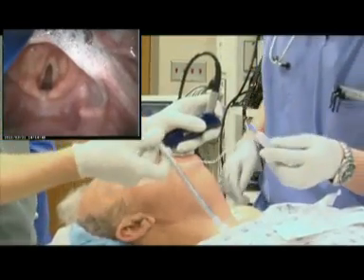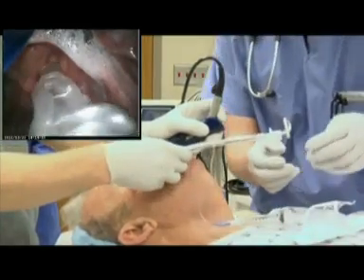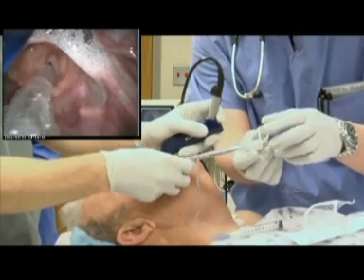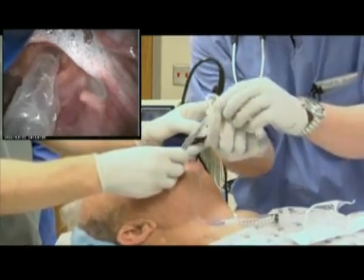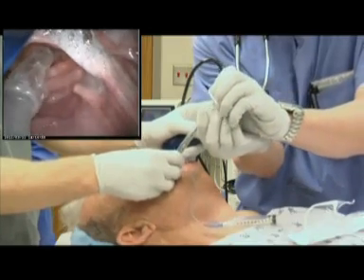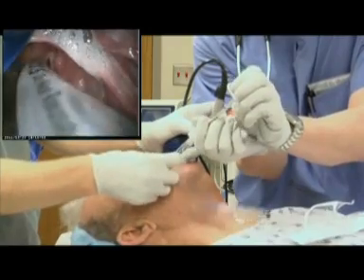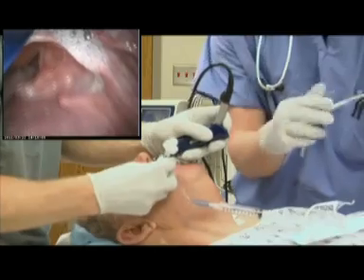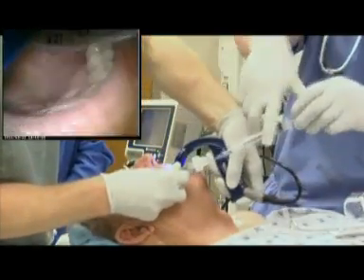After satisfactory glottic view is achieved, attention is again directed to the oropharynx as the 60-degree stiletted endotracheal tube is passed toward the base of the tongue. Watching the monitor once again, manipulation of the endotracheal tube is performed such that positive placement in the glottic opening is achieved. Simultaneously to advancing the endotracheal tube through the glottic opening, the stylet is removed.